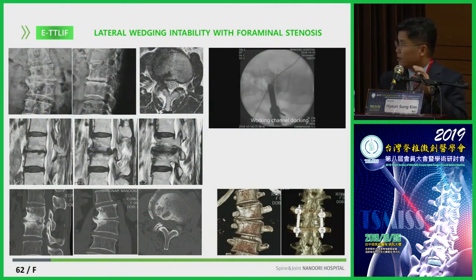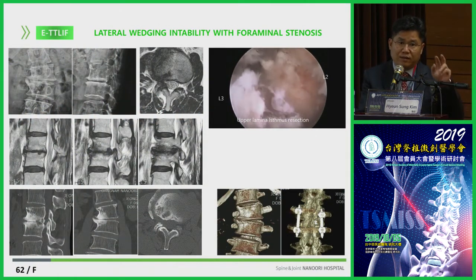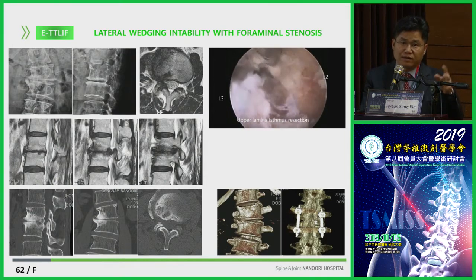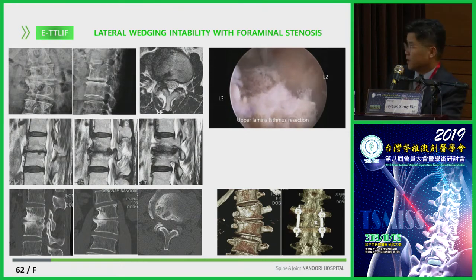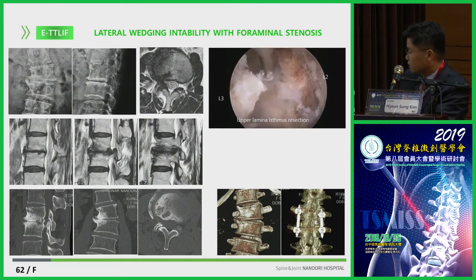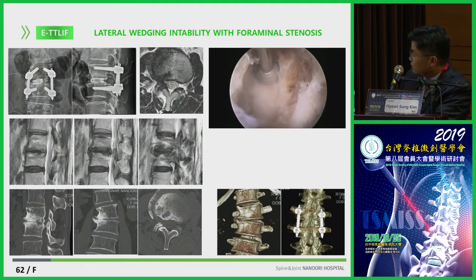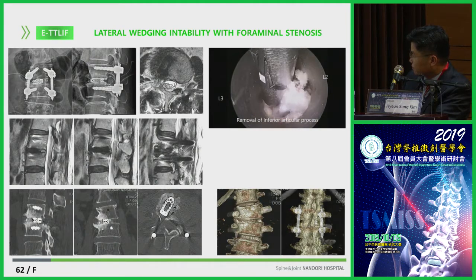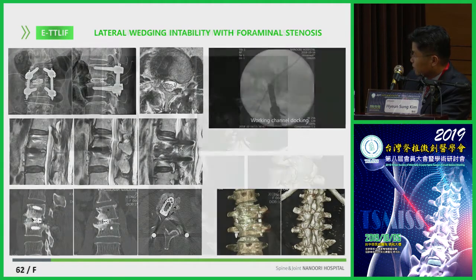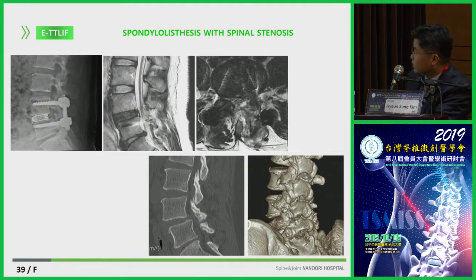Yes, I already mentioned that if we do this process, we can apply it to all kinds of degenerative lumbar fusion cases, like these lateral wedging cases, and more simple cases. And postoperatively, you can see the restoration. Also, if the patient needs endoscopic decompression, the restoration can be done together.